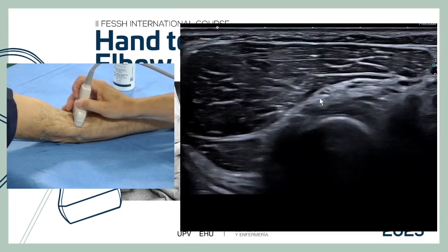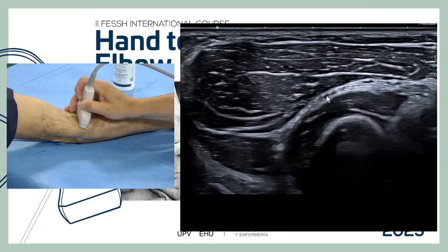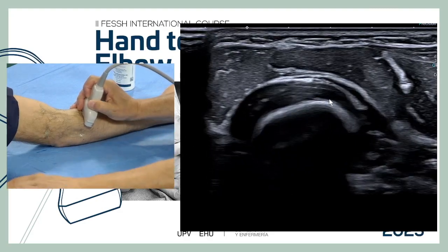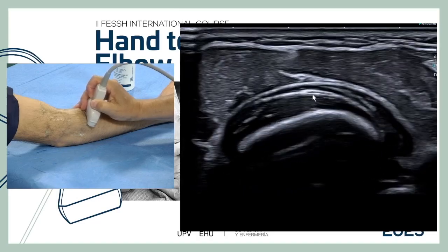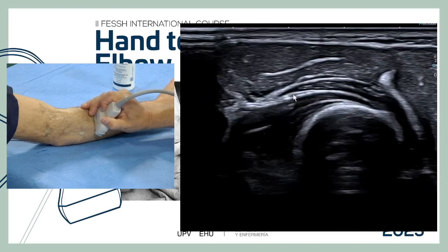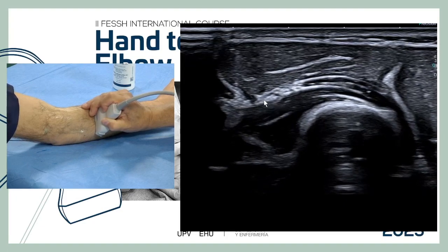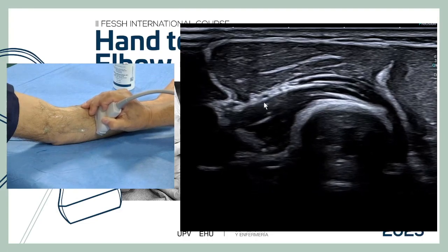The Frohse arcade is the main compression site of the radial nerve. To check the radial nerve, we pronate maximally and follow the profundus fascicle distally. It continues down to join the posterior interosseous artery, at which point the nerve converts into the posterior interosseous nerve.